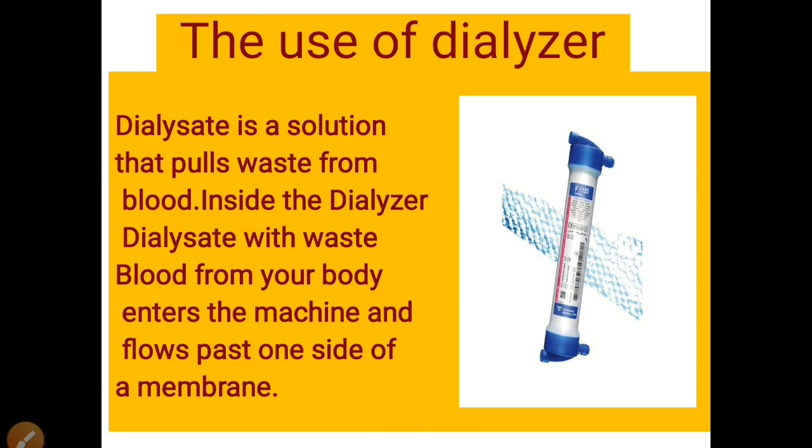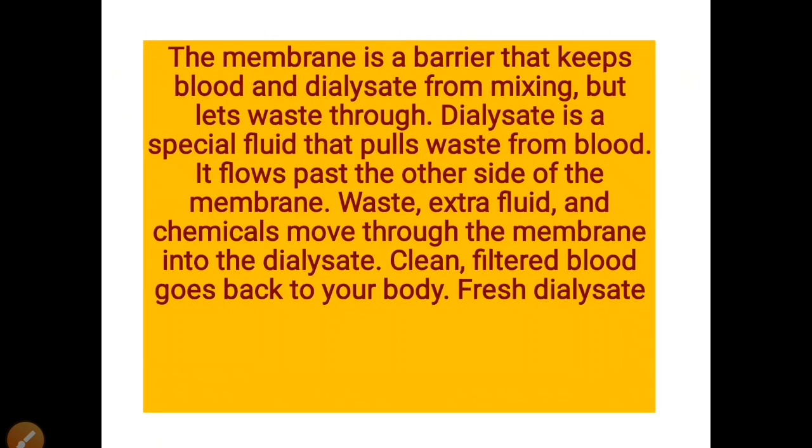Inside the dialyzer, the waste-filled blood from anyone's body enters the machine and flows past one side of the membrane. The membrane is a barrier that keeps the blood and dialysate from mixing but lets waste through. Dialysate is the special fluid that pulls waste from the blood.